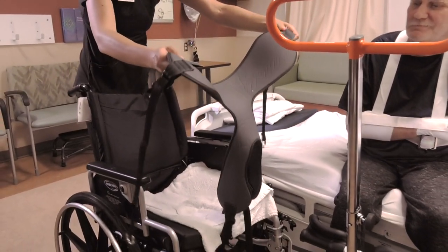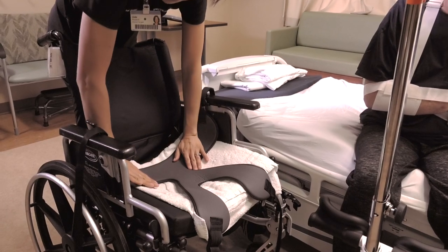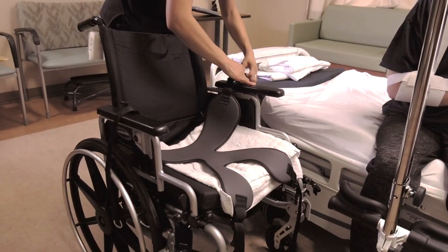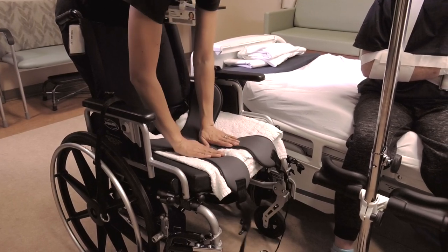In the patient's room, before transfer into the wheelchair, place the pelvic support gray side up and flat side back on the seat. The V-shaped inguinal straps should be in the front. Move the straps on the back of the pelvic support out to the sides, and allow the inguinal straps to hang down over the front of the wheelchair.